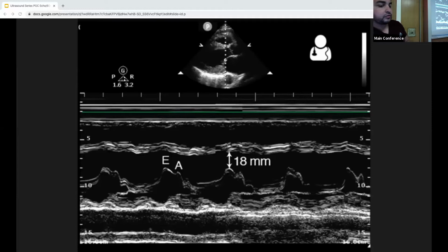The big thing, at least for EPSS, is to see where the septum is and how close the valve gets to it. So at the bottom here, you can see where they measured like 18 millimeters is the E wave of the valve, the very tip. And then you're trying to see that distance to that middle line there, which is the septum. So here it's 18 millimeters. Anything below 5 is normal. Anything above 7 millimeters is a reduced EF, and anything above 10 is moderate to severely reduced EF. So it's a good trick. And we're going to go into how you can also use M-mode later on to look for tamponade.